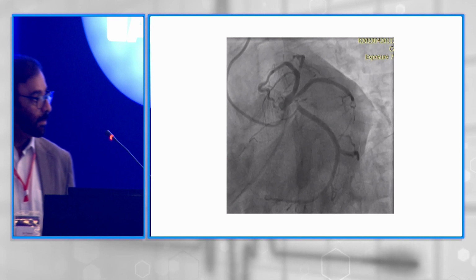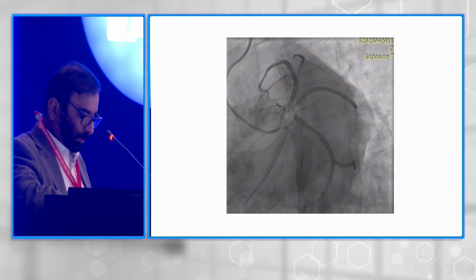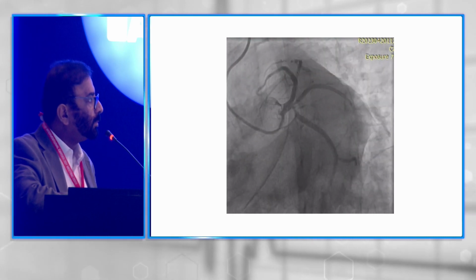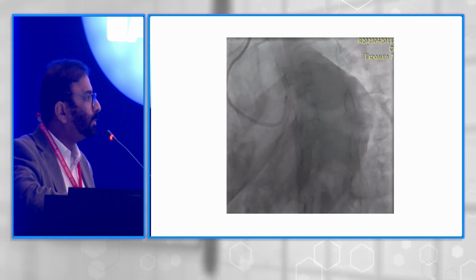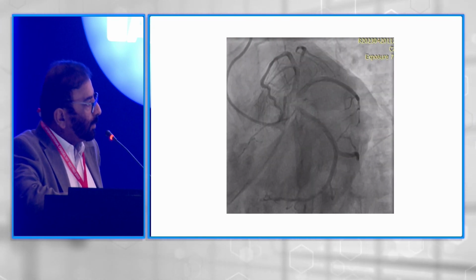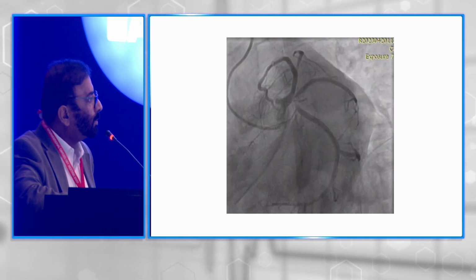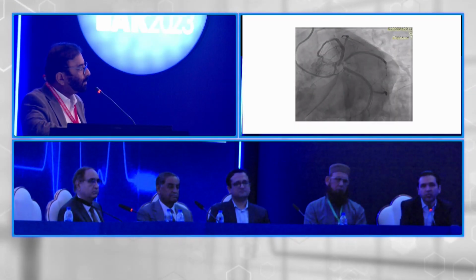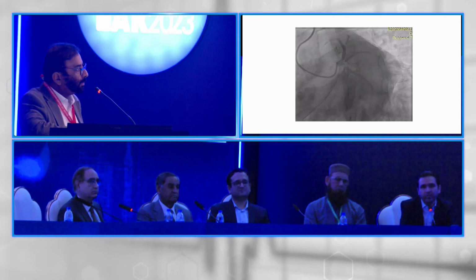It needs to be addressed, obviously. I think imaging will definitely help to see how much plaque is in the ostium of the left circumflex and whether it is extending into the left main. If the left main looks free of disease and not much plaque extends into it, then you can try to nail the stent in the ostium of the left circumflex. The other thing to consider is drug-eluting balloons, although there's not good data behind it.